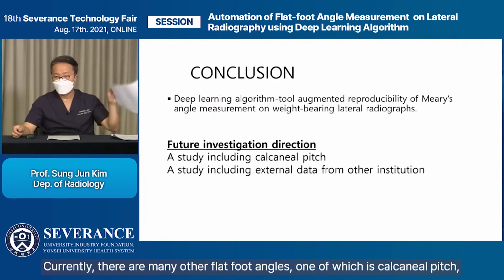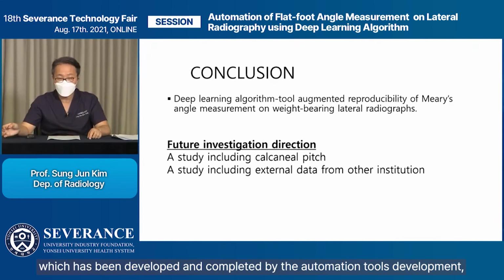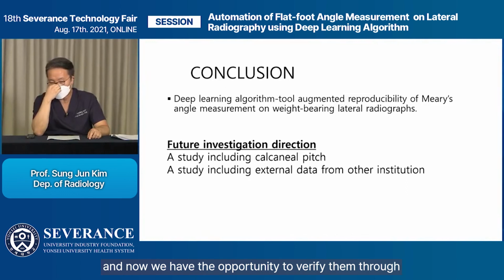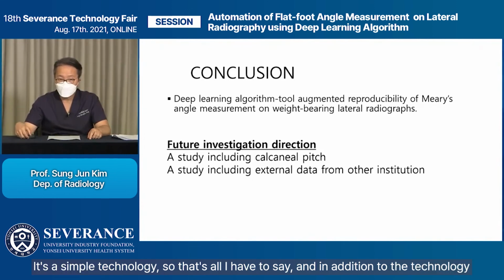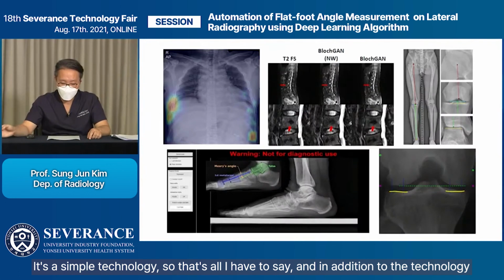Currently, there are many other flat foot angles, one of which is the calcaneal pitch, whose automation tool has been developed and completed. And now we have the opportunity to verify them through other institutions' images based on the developed tools. It's a simple technology, so that's all I have to say.